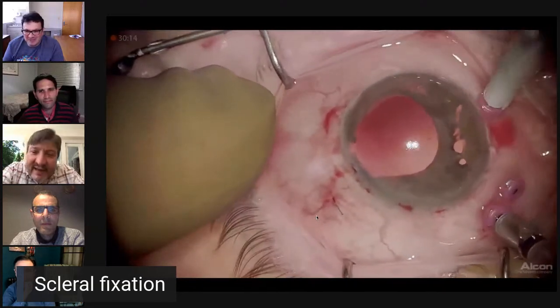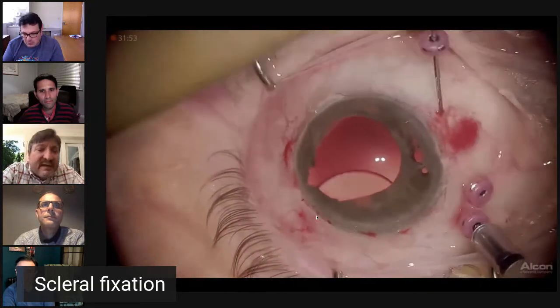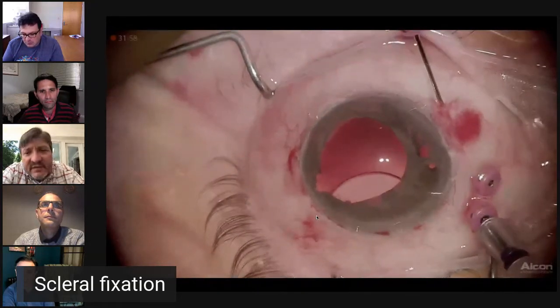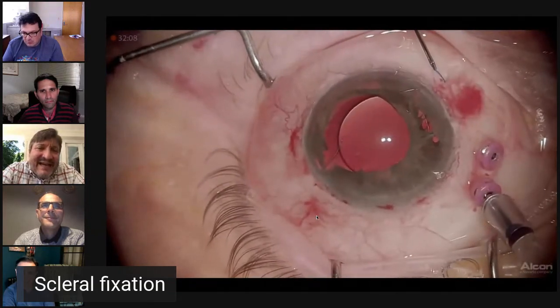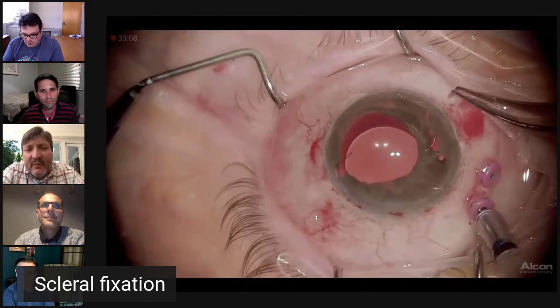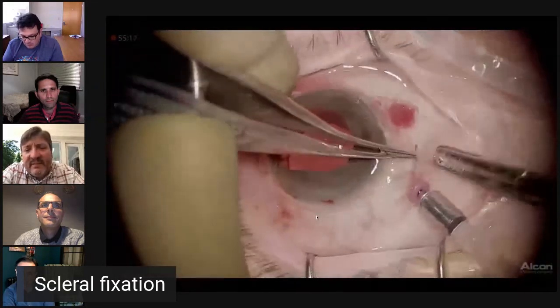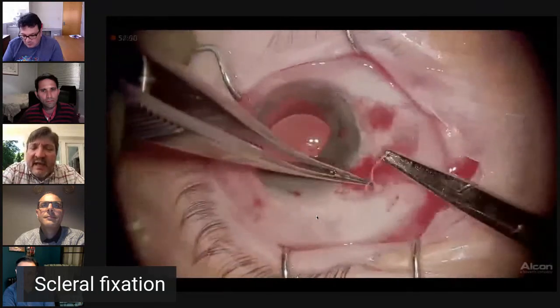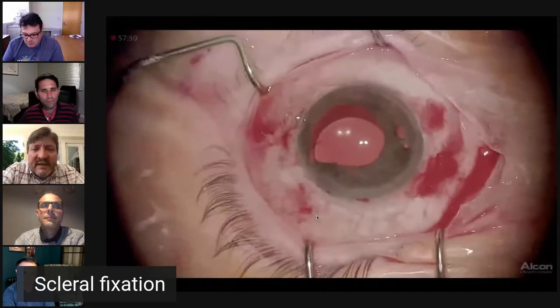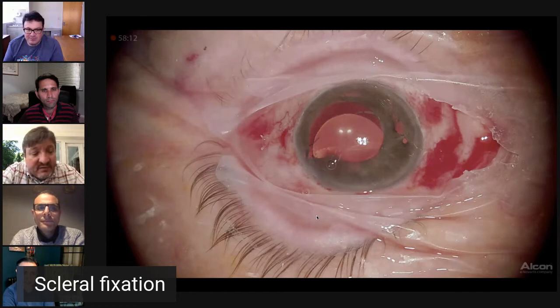And so we have to go back in and fish it out, and it's fiddling work and it's frustrating. And these Yamanis, they show these sexy videos. They're fiddling, they're frustrating. This case ended well. It's nice that we were able to recycle this three-piece lens. We just put a bunch of conjunctival sutures in and close. And he went on to do well. But I still worry. Even a minor trauma could, I think, easily dislocate this lens back onto the macular surface.